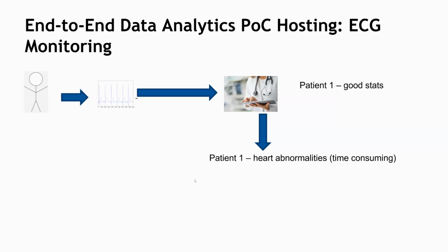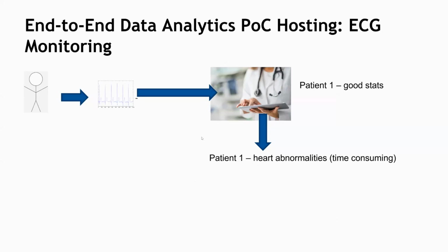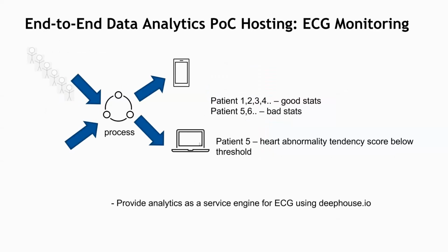Small changes from regular norms can help capture health in a better way. And there are a few companies out there working on this to reduce the amount of time spent in analysis of ECG waveform while you are in the comfort of your daily activities.